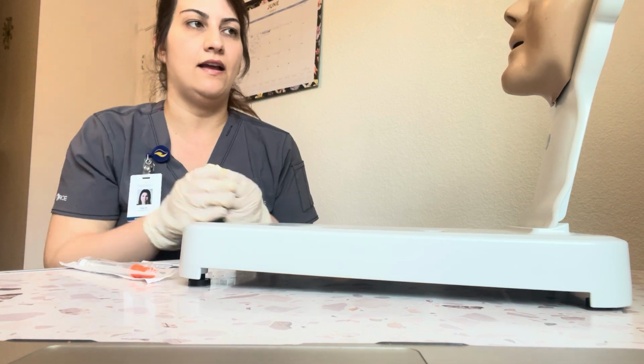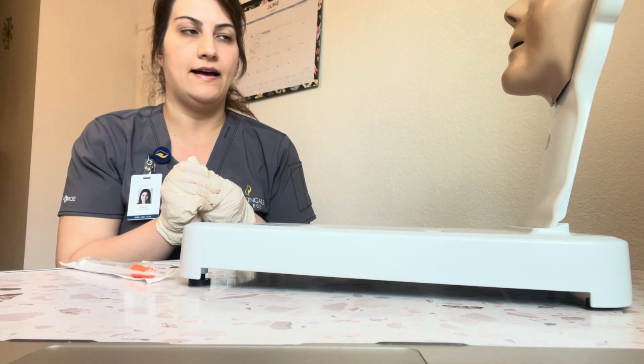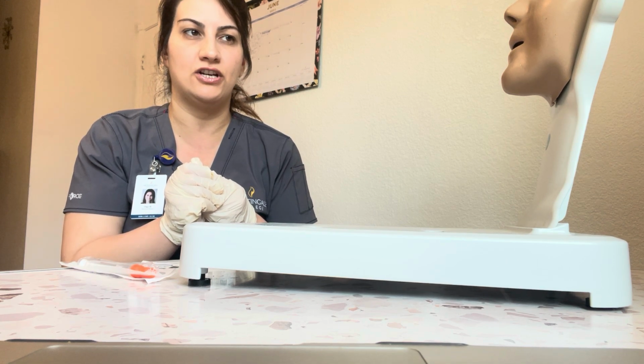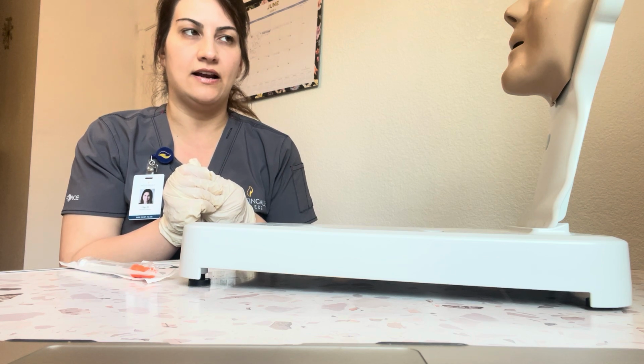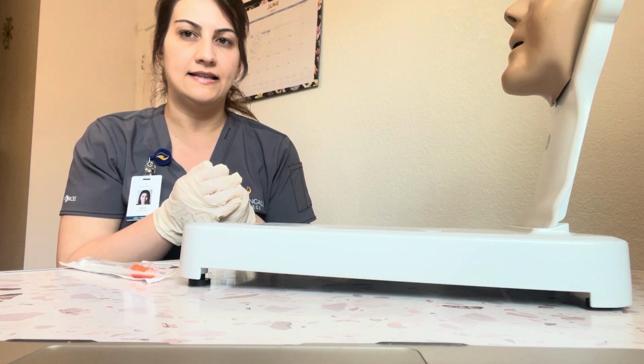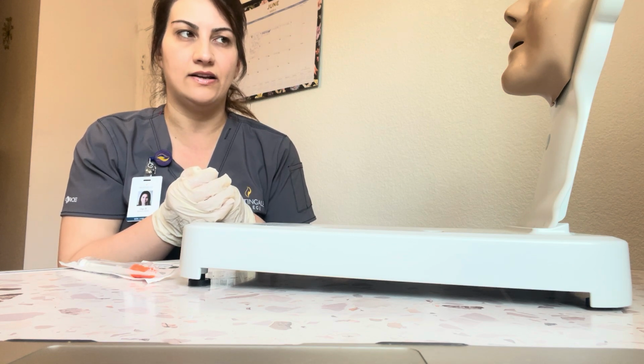Okay, so Miss Smith, you're going to be receiving two different insulins within the same injection, which is going to equalize to 12 units. The first insulin that you're going to be receiving is regular insulin. It is a short-acting insulin.